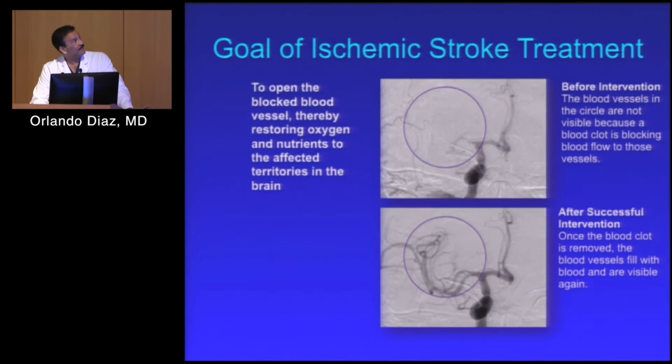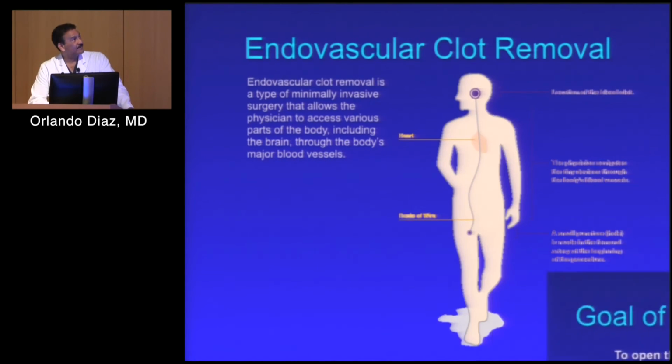So this is unbelievable. So what is the goal of the treatment? To open, revascularization. This is the right internal carotid, this is the ACA, there should be a T here. There is no blood vessel here. After intervention, the M1 segment is short for some reason, M2 segment, and then the rest is open. That's the goal. So we come, the patient is awake.